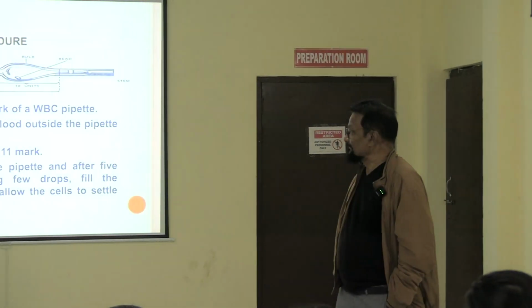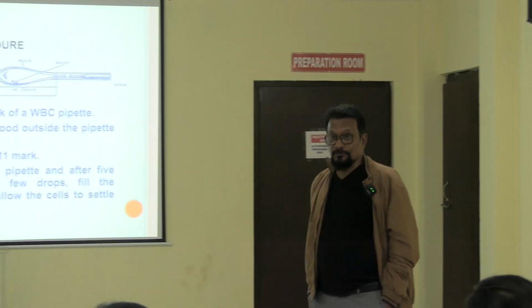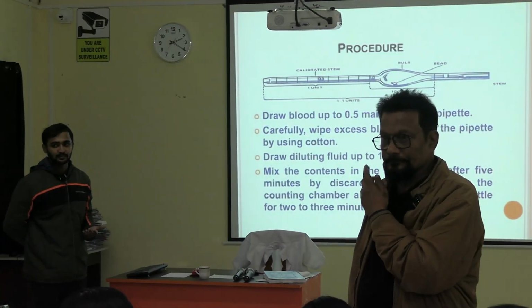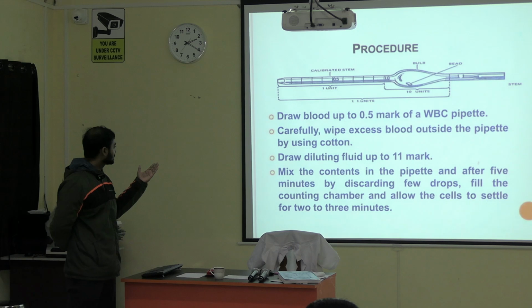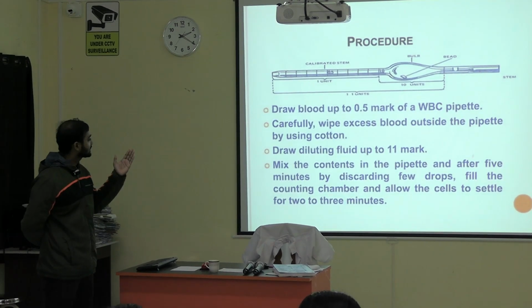Sir, here it is written, sir. But actually we cannot use it. So you got the point. It will make the concentration high inside the pipette, so the fluid will be sucked. Then we will take the diluting fluid till mark 11.